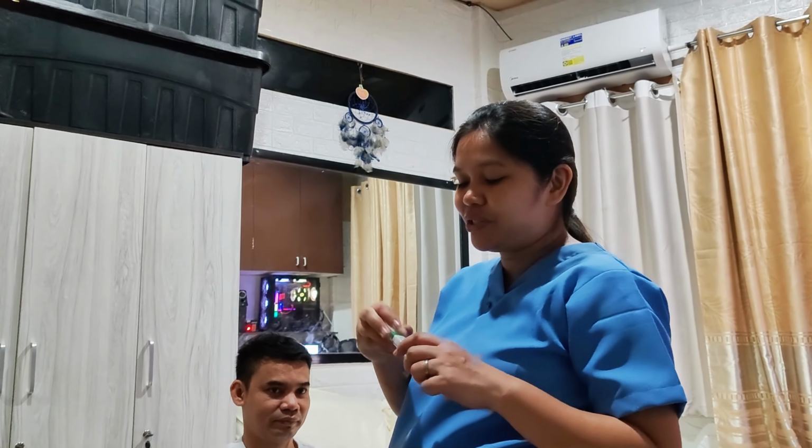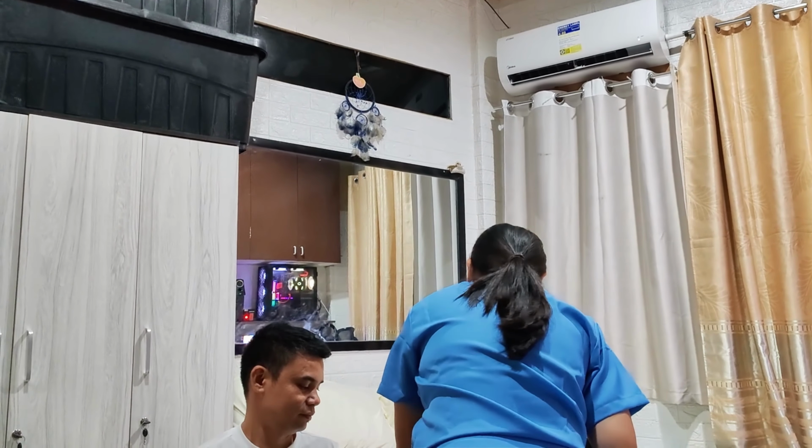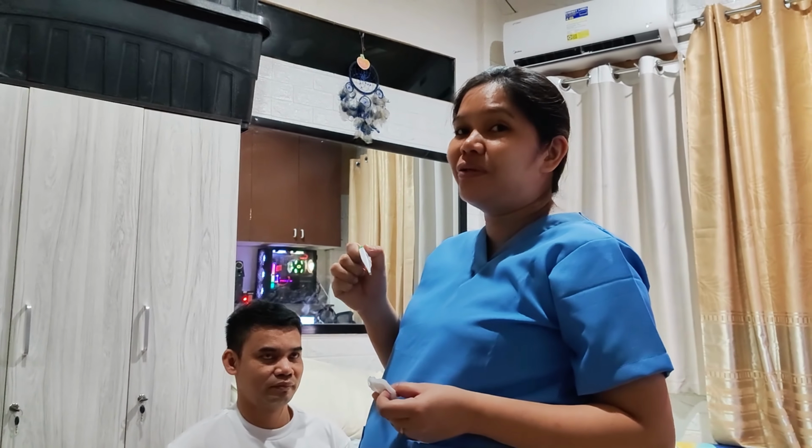Ensure that your thermometer is clean. We can use an alcohol swab to clean the thermometer.